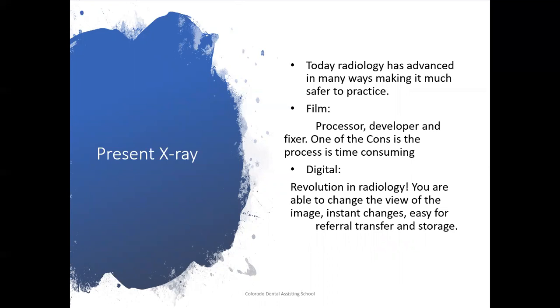A couple of years ago in dentistry, we used to use film, and there are still some offices out there that utilize film. There's nothing wrong with that. It still takes a great x-ray. Some of the disadvantages of film, though, is that you have to have a processor, which includes the developer and the fixer, which are two different chemicals that we use to develop the film, and it takes a lot more time to take the film and develop it. By the time we're done with it drying and getting back to the patient once we've examined it, we might need to retake that film, but we don't know until it's completely processed.